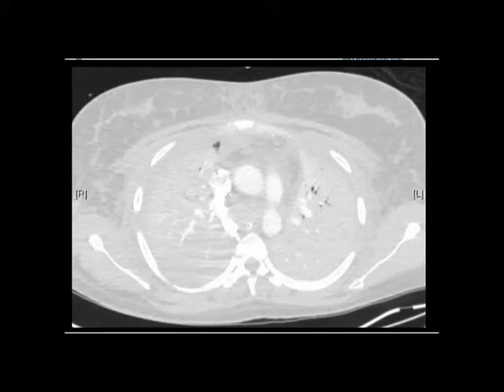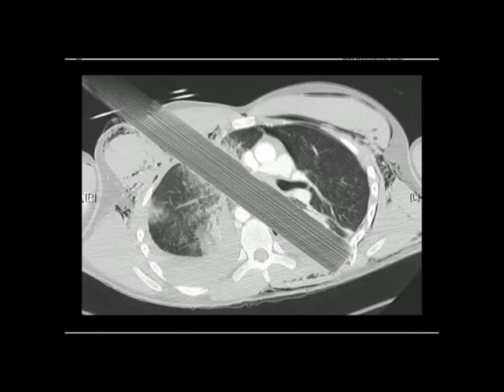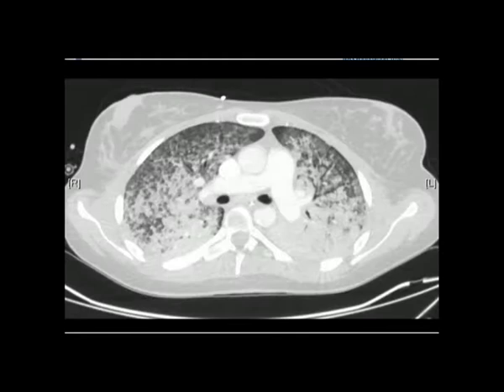What sort of patients do we have? Many of them have CTs like this, complete hepatization of the lungs by the time we get them onto ECMO. And this is a common thing. But we also offer it to trauma patients, and they can do just as well. This is not artifact, that is a post through the chest, managing to miss every vital organ on the way through, remarkably. Pulmonary hemorrhage, often considered a contraindication to ECMO, do very, very well, albeit you need to run them without heparin for a while.